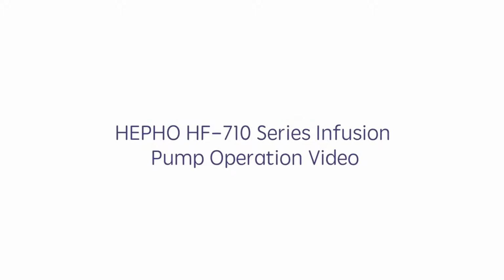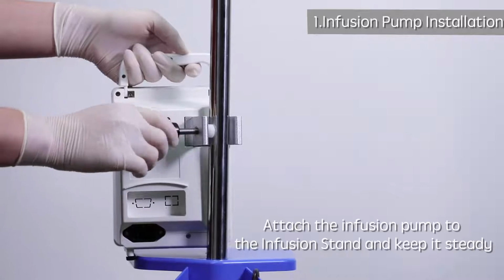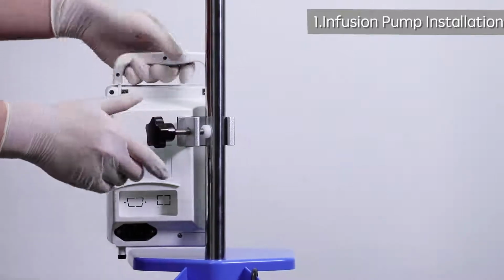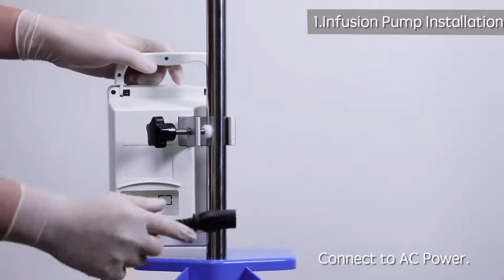HEPHO HF710 series infusion pump operation video. 1. Infusion pump installation. Attach the infusion pump to the infusion stand and keep it steady. Connect to AC power.